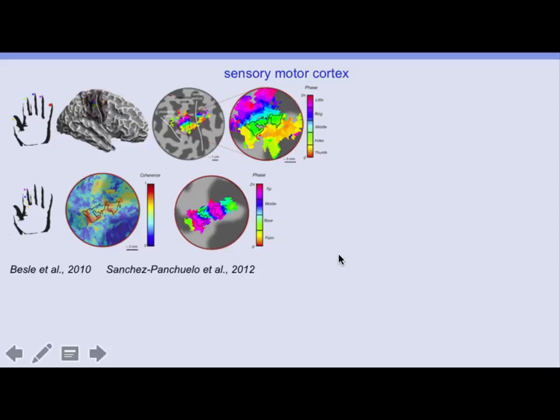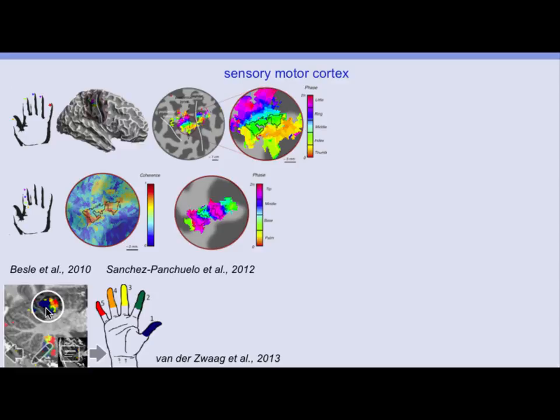High-resolution fMRI has also been applied in sensory motor cortex. Much work was pioneered by the Nottingham group, looking at different digit representations along the central sulcus. Gradients for different fingers and positions perpendicular to that can be seen. Wietzke-Vander even performed digit representation mapping in the very fine structures of the cerebellum.